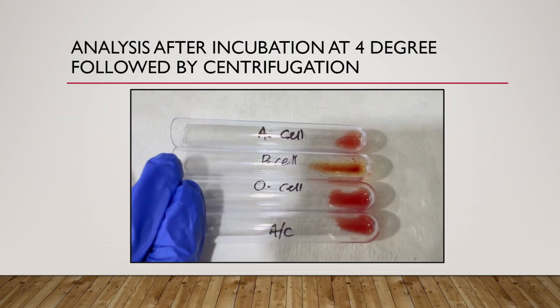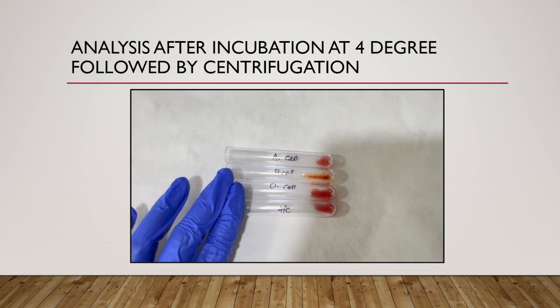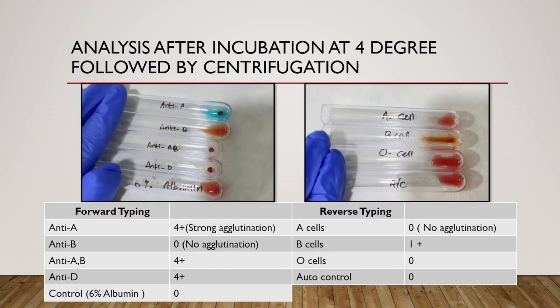These are the results we have obtained after incubation at 4 degrees Celsius. We can see a 1 plus reaction that has developed in B cell. This is the side-by-side analysis of the results that we have obtained after cold enhancement testing. We can see that there's a strong 4 plus agglutination reaction in anti-A, anti-AB and anti-D in forward grouping, pointing towards A positive blood group, and in reverse grouping we can see a 1 plus agglutination reaction in B cell, which was initially not there in testing at room temperature. This points to a weak anti-B antibody which was not initially detected, and later got enhanced on cold enhancement testing, and it got detected now.